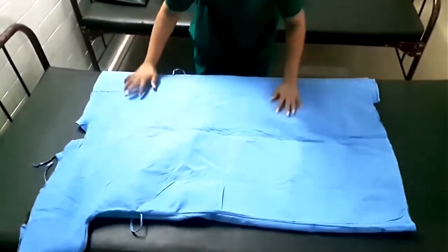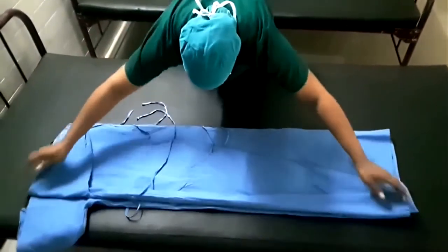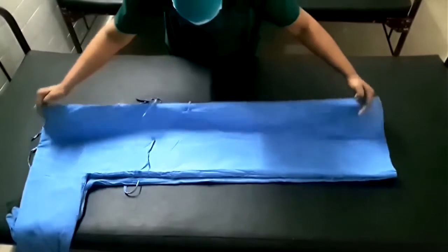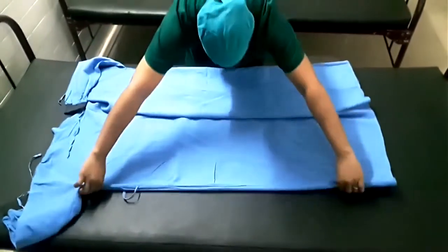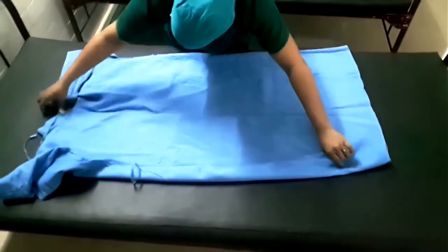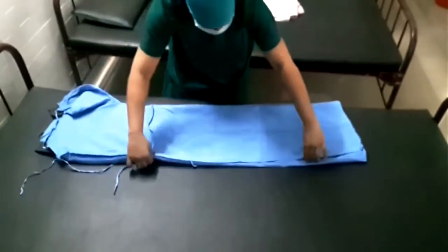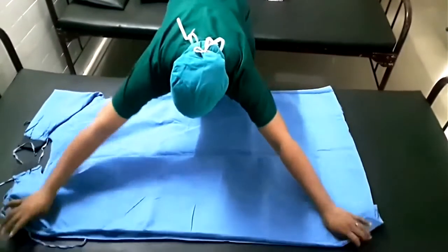So this is what we normally use. Fold it into half, and you get the flap on the back. That again you fold into half, the way she is demonstrating there. Do the same thing on the other side also. Right? Hope it's very clear here.